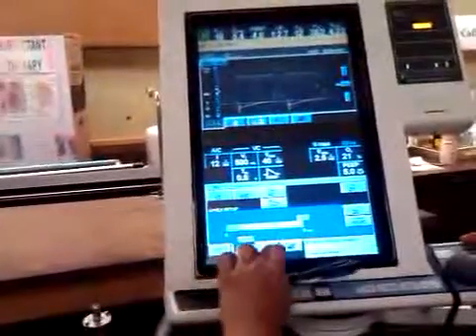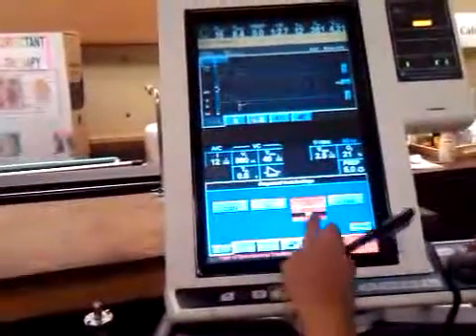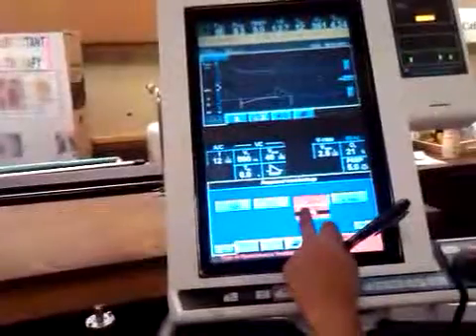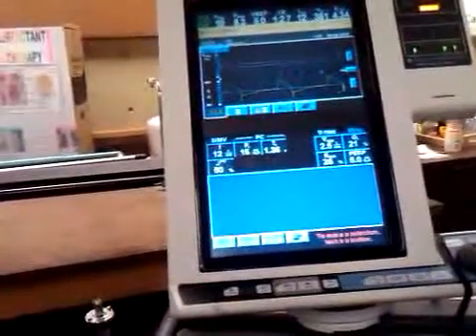That's all I know. To do your SIMV, I just know how to do it from the recording. Okay.